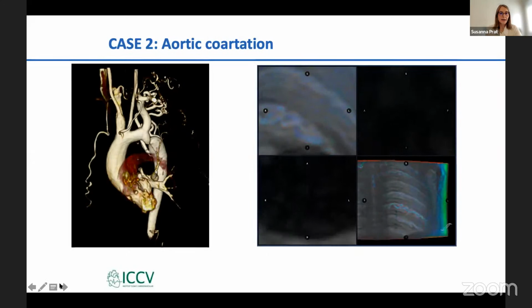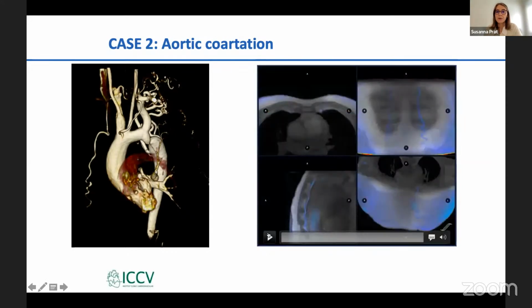As well, if we go to the 4D flow of this patient, we can see these prominent mammary arteries, both of them. Usually you don't see them. And this is the clue. This patient has a hemodynamically significant aortic coarctation. And with these nice images, in fact, you don't need gradients; you know that this aortic coarctation is significant.